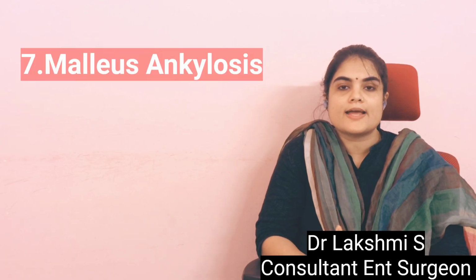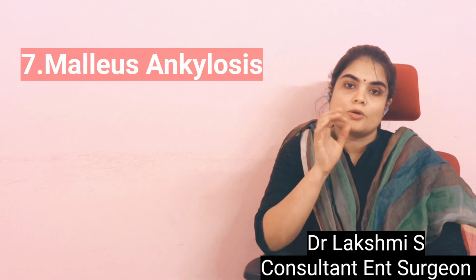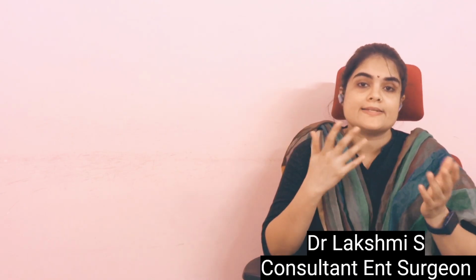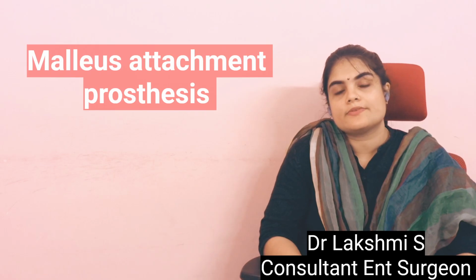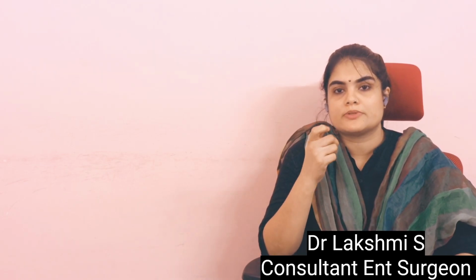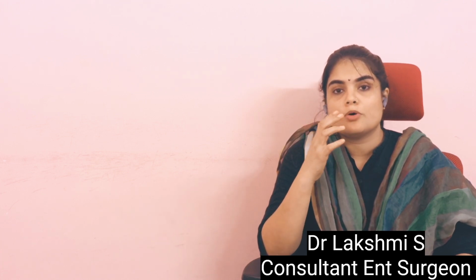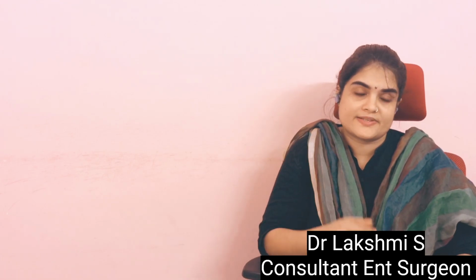That is, the malleus is ankylosed to the roof or the wall of the epitympanum with a bone or a spur. So in this condition, you may have to remove the incus and the head of the malleus and use a malleus attachment prosthesis. So otosclerosis can be associated with malleus fixation. On pneumatic otoscopy or when you do tympanic membrane mobility testing, there will be reduced movement of the umbo or the handle of the malleus. So at that time you have to suspect malleus fixation.